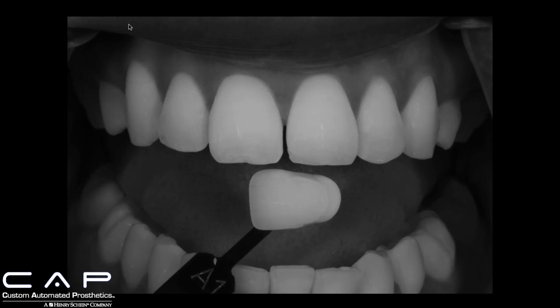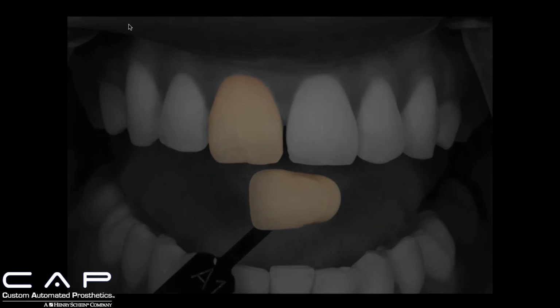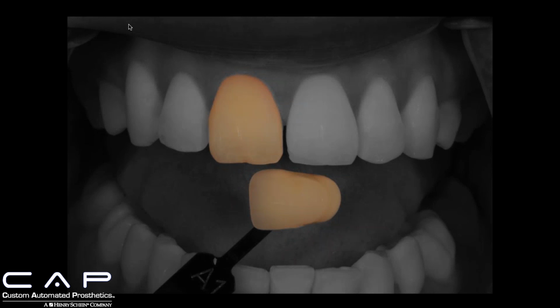Maybe you can play with the contrast, bump that up a few notches, but this helps me to see the value level of the tooth and the shade tab, and this tells me that A1 is the closest thing, or near the closest thing to use for this.